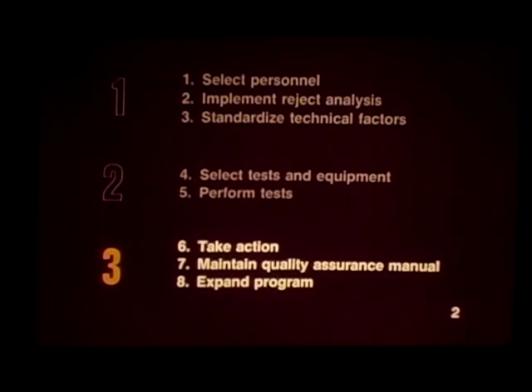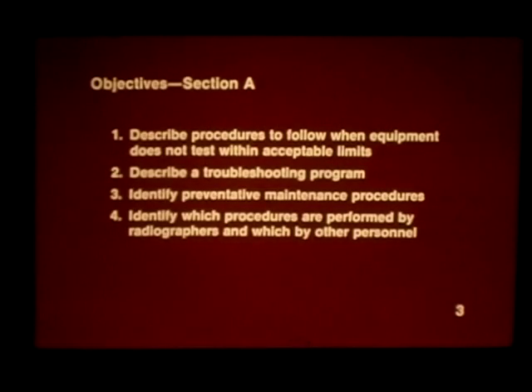Step 6 describes taking action to accomplish corrective and preventive maintenance. Step 7 is concerned with the documentation of the quality assurance program, and Step 8 outlines what must be done to expand the program.